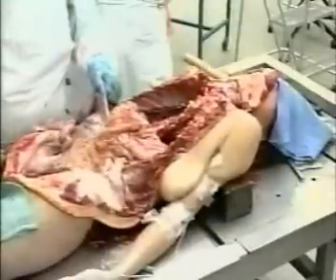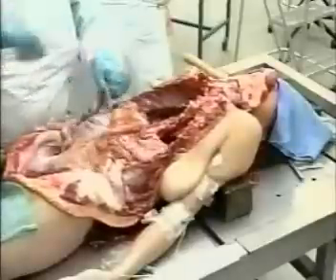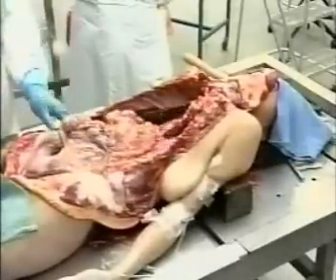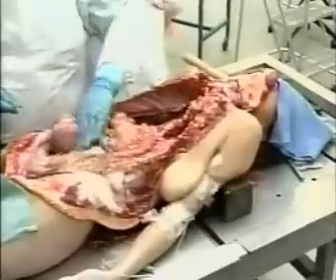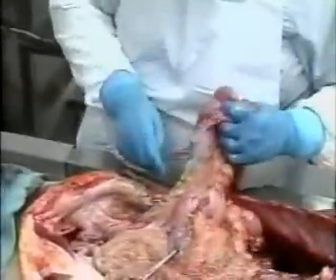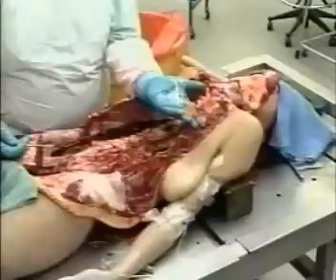What he's doing now is putting a clamp on the proximal end of the small intestine — the duodenum — and then he'll free up all of the intestine so that it can be removed in a block. That's an adrenal gland, which he's dissected off the top of one of the kidneys.